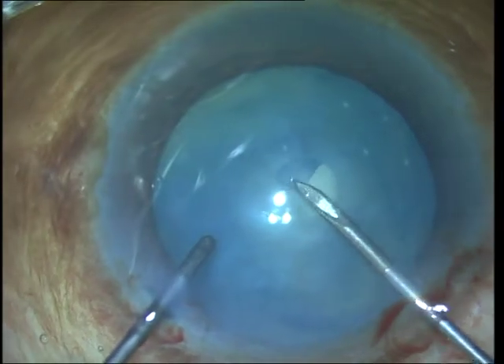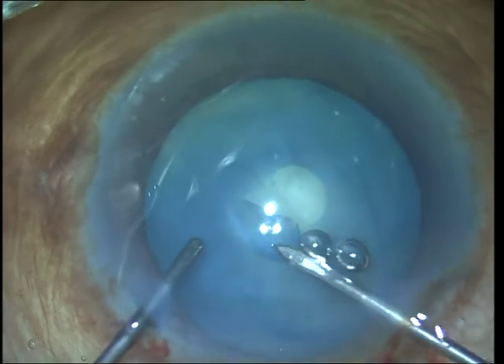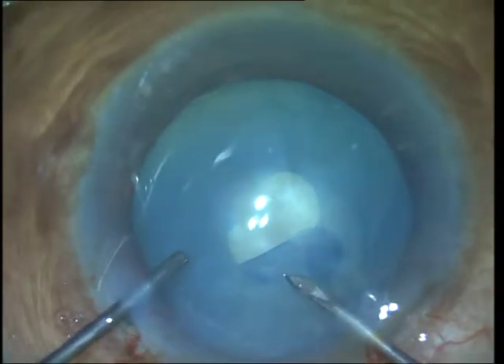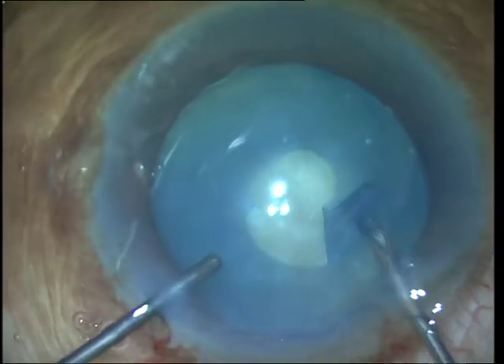The problems that you can face in white cataract are: one is rhexis, and this is because the anterior capsule may be thin and fragile or fibrosed, and the intralenticular pressure is often increased and this makes the anterior capsule convex, thereby increasing the risk of a rhexis run out.